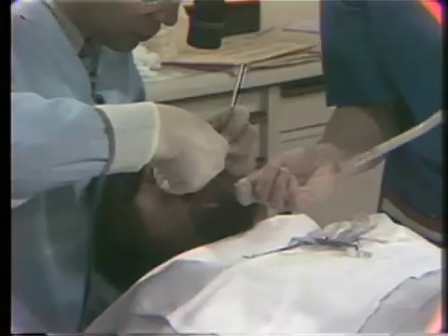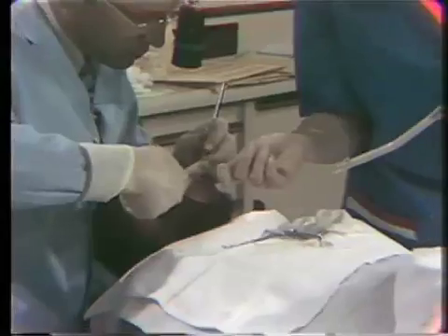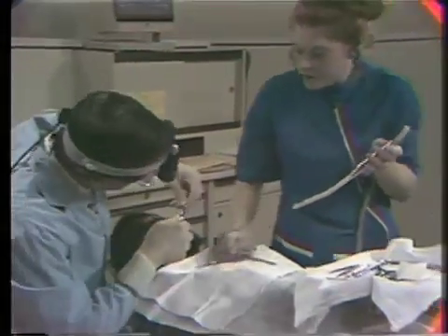I'm going to put one more suture in the distal of this bicuspid to increase the apposition of the tissues on the distal.